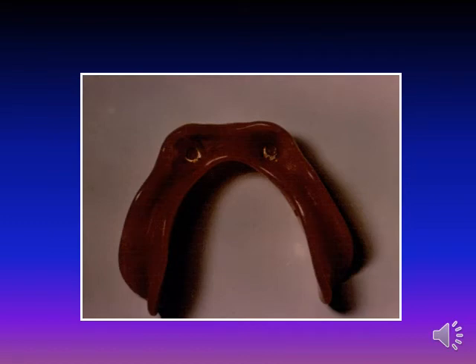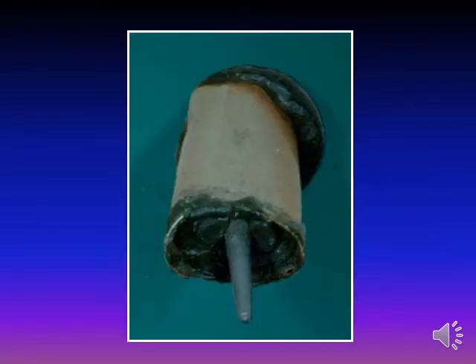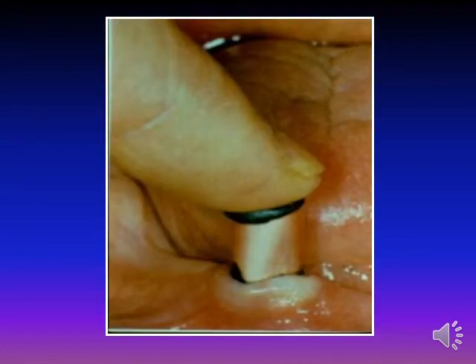This denture with attachment, female portion, this attachment is called Rotherman attachment. This abutment with this is for impression of the coping. We need a rubber band, copper band, and put in it silicone impression material and post, and impression, right, like this.